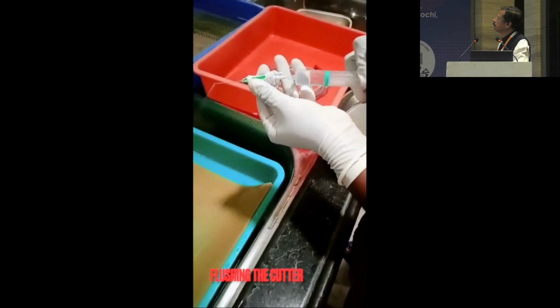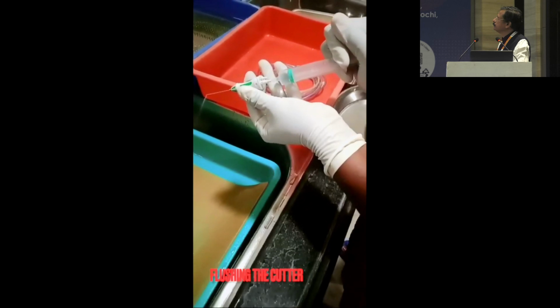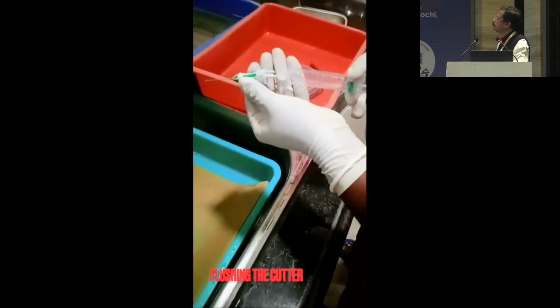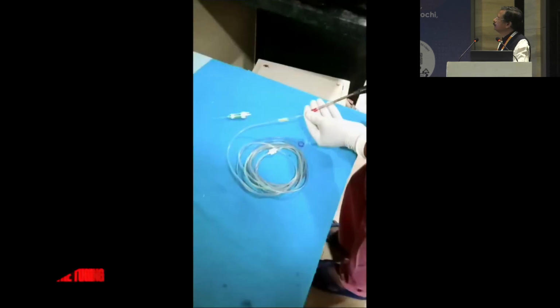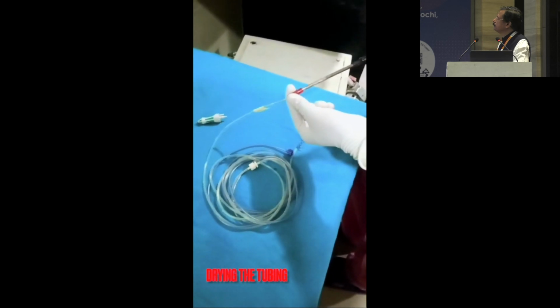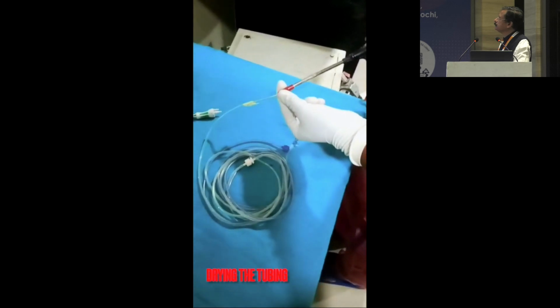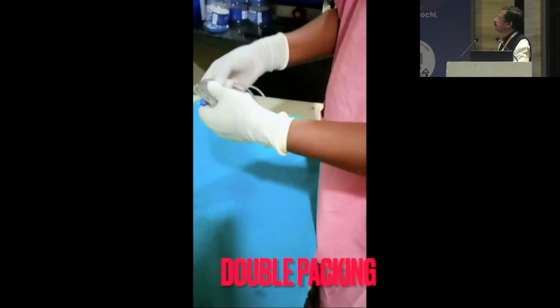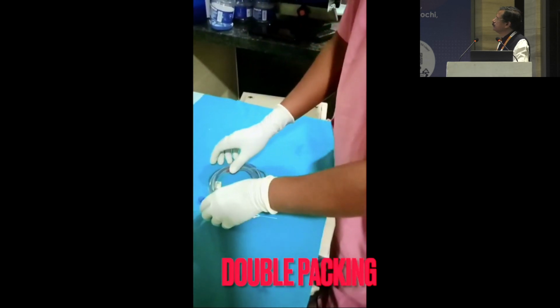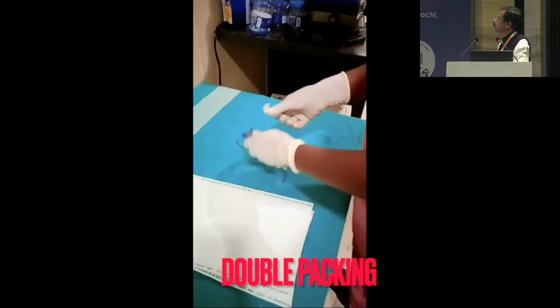Flush the cutter with BSS just to doubly ensure that there is no clogging in the cutter. The tubing is dried with the help of an air compressor. Before packing, the tubing should be folded in a rounded fashion and a bandage applied.